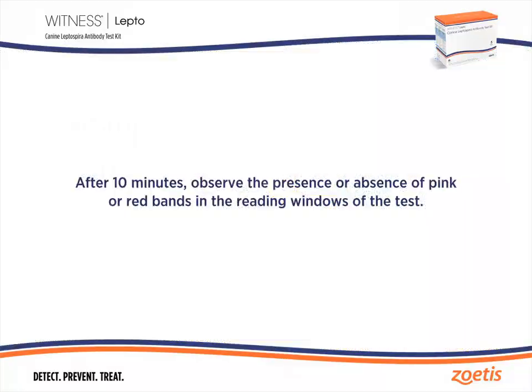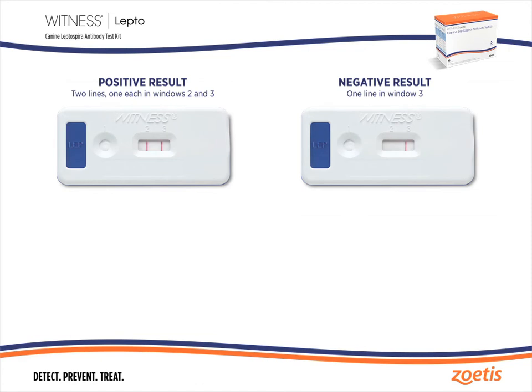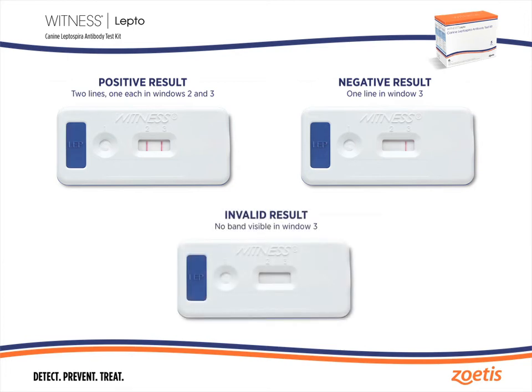After 10 minutes, observe the presence or absence of pink or red bands in the reading windows of the test. The test is positive for anti-leptospira IgM if one band is visible in both window 2 and window 3. The test is negative if there is no band visible in window 2 and one band is visible in window 3. If there is no band visible in window 3, the test is invalid.